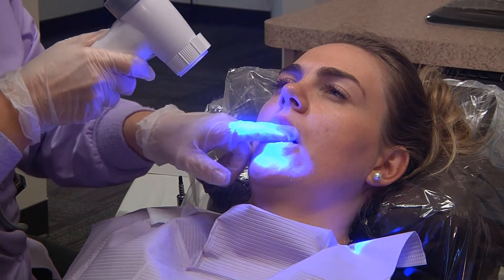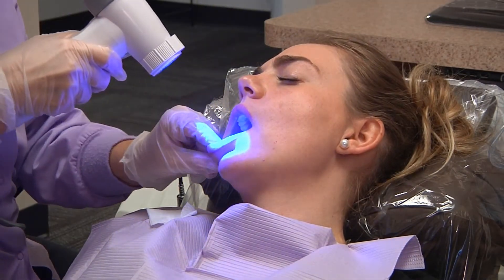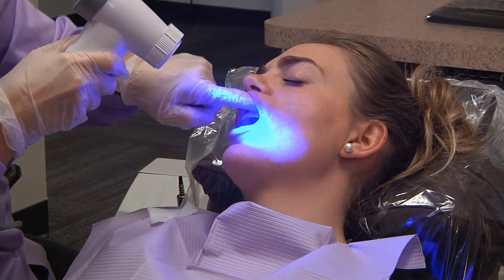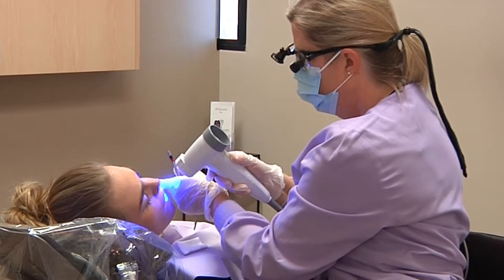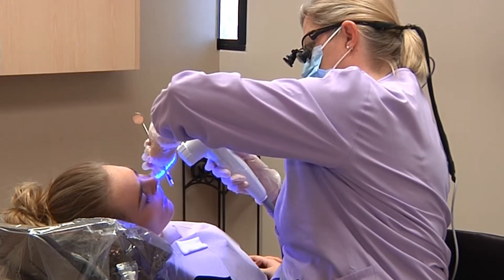I'll have you open please and turn towards me. So I'm looking at all your lips and your cheek tissue through the scope.